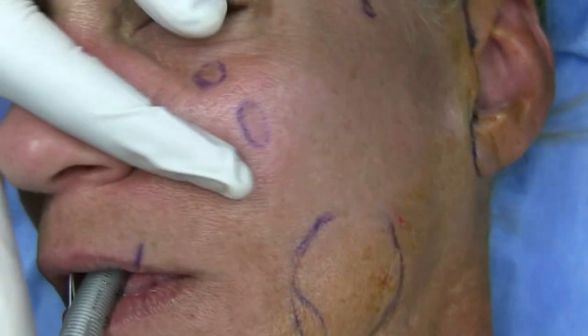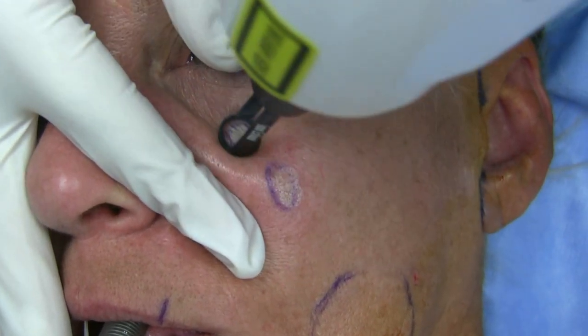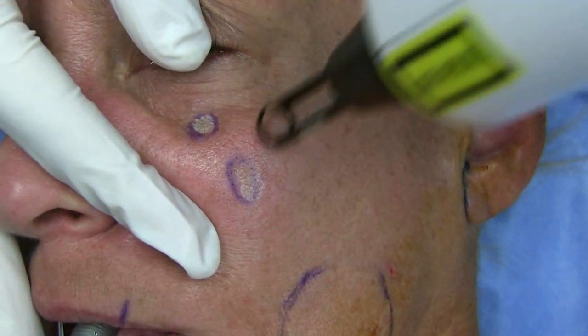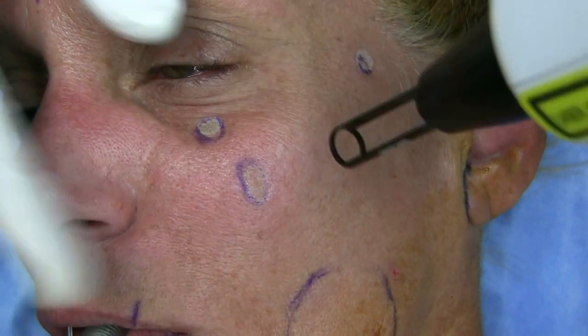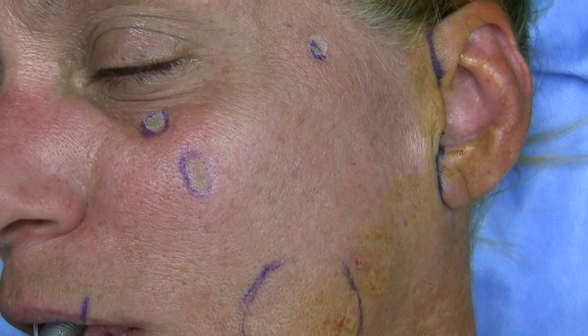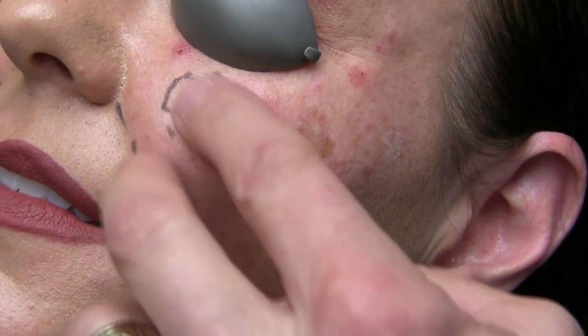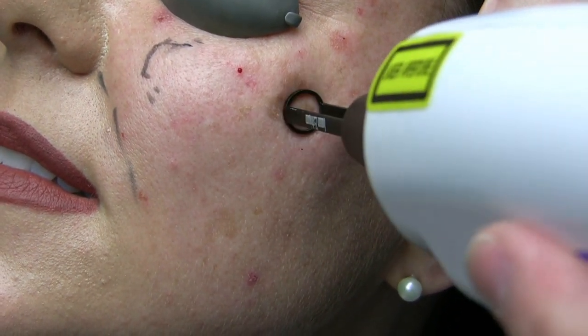We have a couple over here. We'll probably do two passes with this. You can really do three to five passes on the average person but you always want to be conservative. We're getting ready to do some fillers in the cheek, and she's got these large lentigos or brown spots here, so we're going to use the erbium for this.